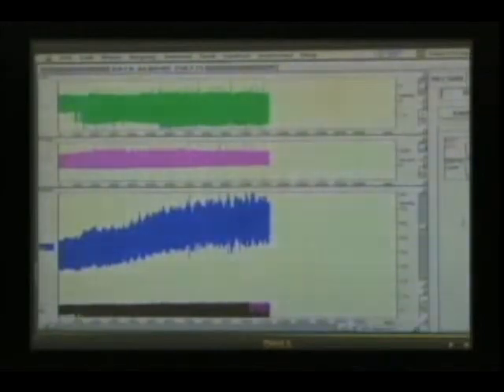The airway pressure varies between 2.5 and approximately minus 7.5 millimeters of mercury. The peak systolic blood pressure remains at 80. The peak carotid blood flow is approximately 200 milliliters per minute. And seen here, the intracranial pressure and right atrial pressure, in pink and black, are approximately 5 over minus 5.